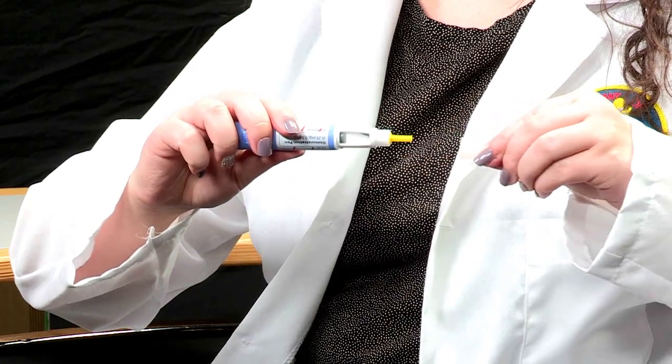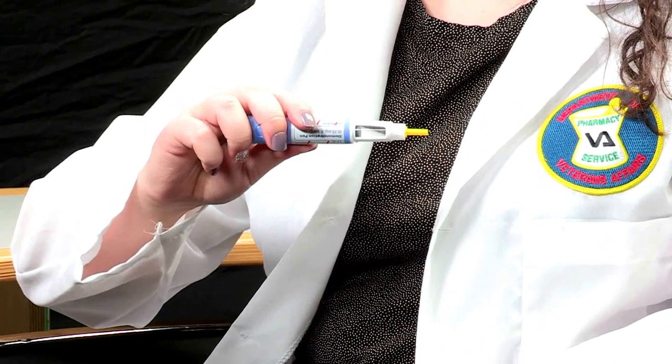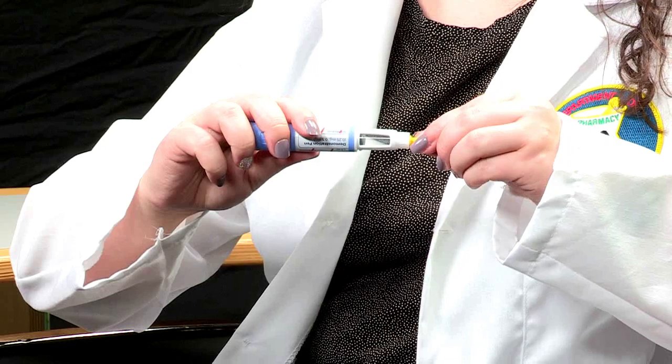Now pull off the outer cap and place it to the side. Then pull the inner needle cap off and throw it away. As a reminder, you will need to make sure you use a new needle with each injection. It is also important to make sure you never use a bent or damaged needle.